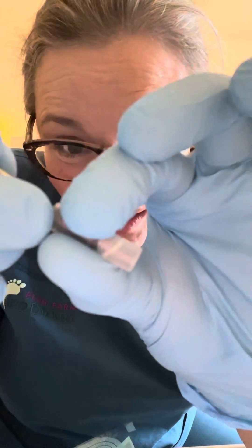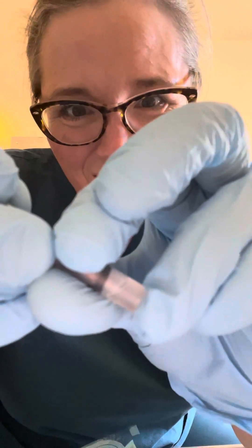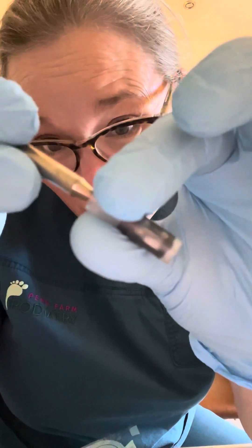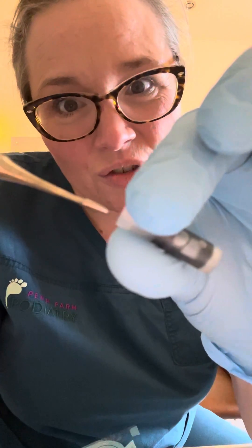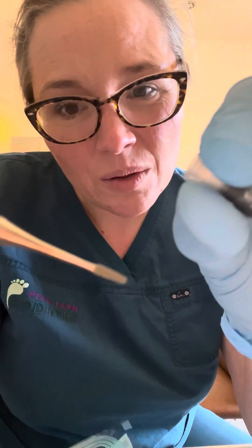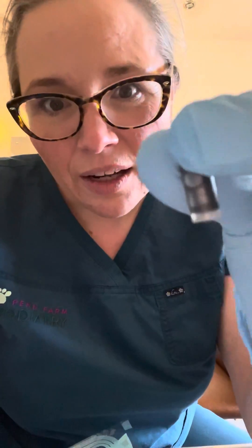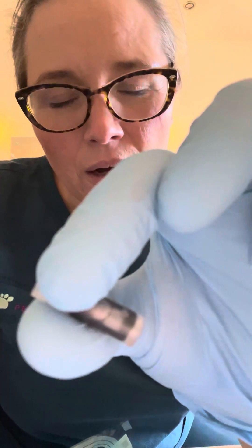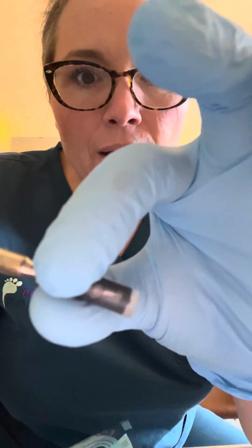If I push with a bit of effort, the black bit starts to move, and then suddenly the fluid gets to where the black file can reach it. Then I can drag it out with a little bit on the tips of the black file, and that's how I apply it. I can usually get one side out of one ampoule — though I had one this morning where I used probably one and a half ampoules because it was a bit of a mucky one.